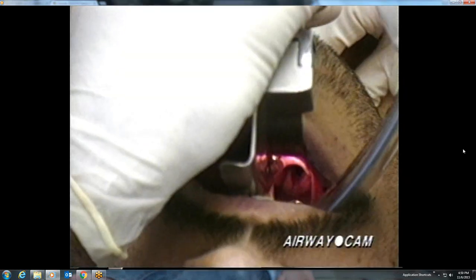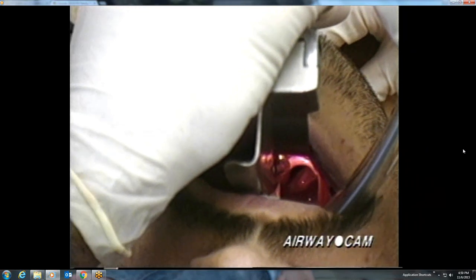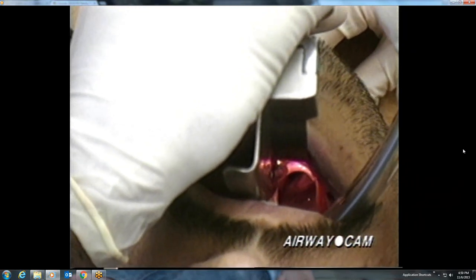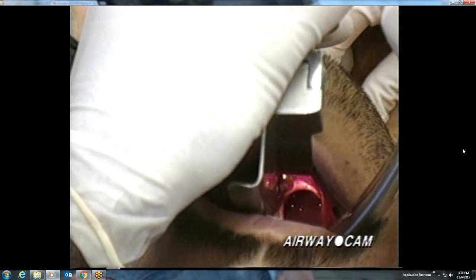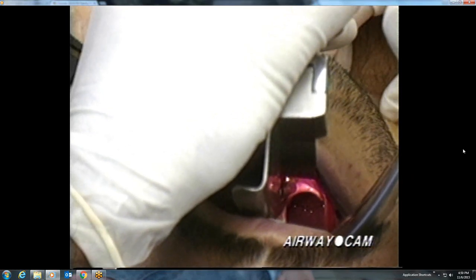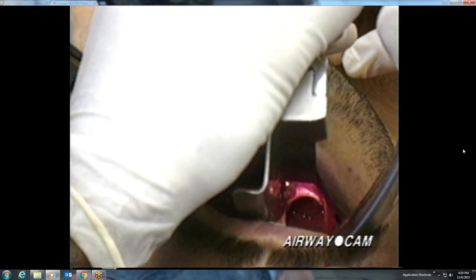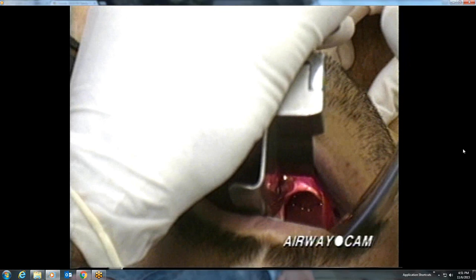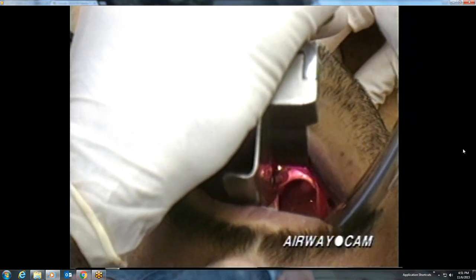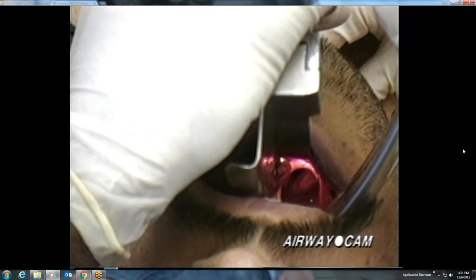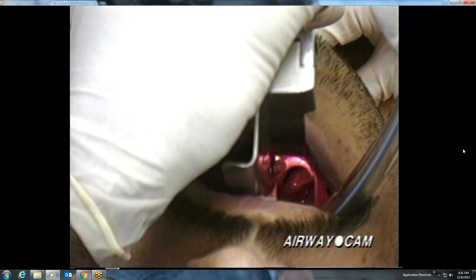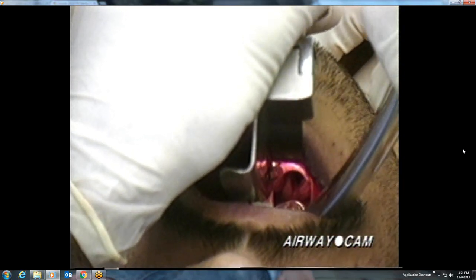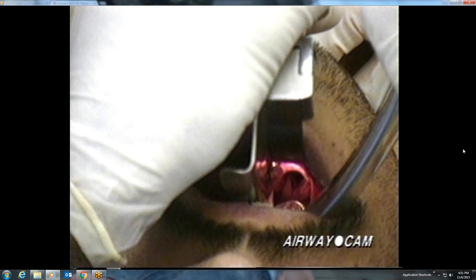In slow motion, note how the epiglottis is brightly lit, positioned directly in front of the light source on the curved blade. An assistant moves the larynx and posterior cartilages in a posterior direction with manipulation of the thyroid cartilage from the anterior neck. The glottic opening is relatively dark and the true cords are not seen because of shadowing by the epiglottis. Nevertheless, the posterior cartilages and interarytenoid notch clearly mark the entrance into the larynx.